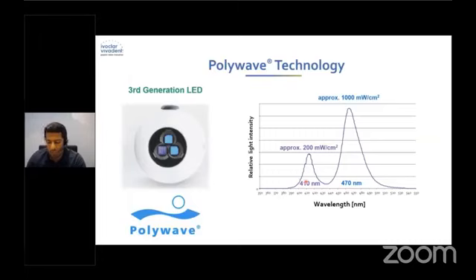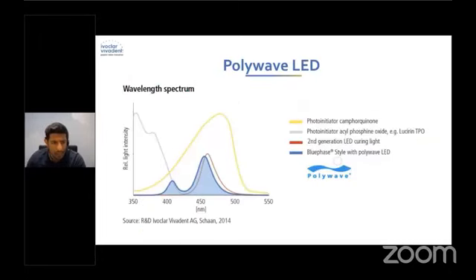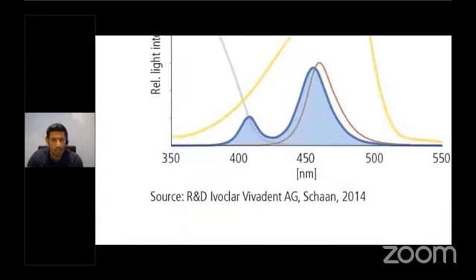You're going to find, if I show you the next slide, that with this broad spectrum, you're going to be able to initiate all different types of photoinitiators in the market that are used for the composites. So you've got your Lucerin here, you've got your camphorquinone here, and this is the 2nd generation LED, so it's only going to initiate the camphorquinone, but not so much of the bleach shades with Lucerin, for example. But if you've got a broad spectrum, if I zoom in, you're going to find that it will initiate those bleach shades and your adhesives that have that, okay?